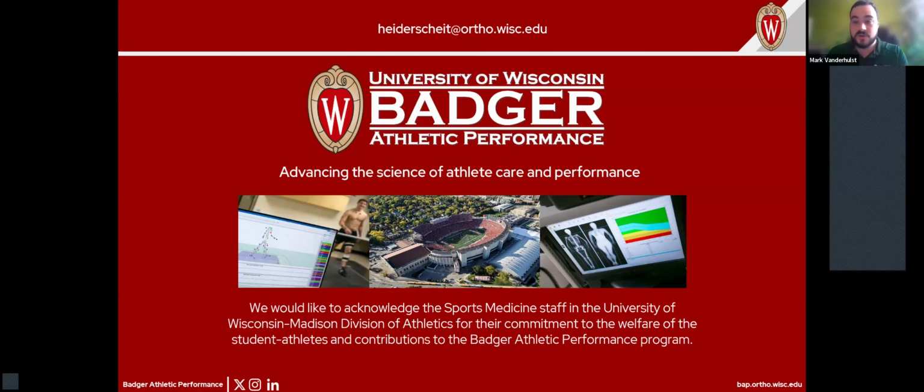Excellent. Great feedback. We have a couple questions popping in. One question is, what's the feasibility of using this? This involved two individuals doing the scanning here. How could you perform this test alone in the clinic? Is that feasible, or are two bodies needed for that?